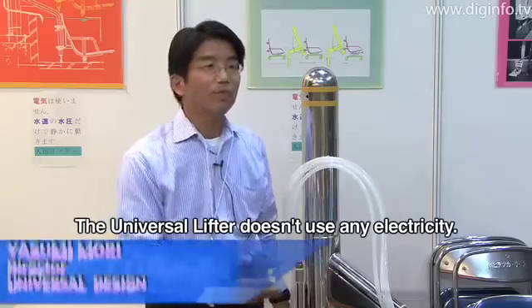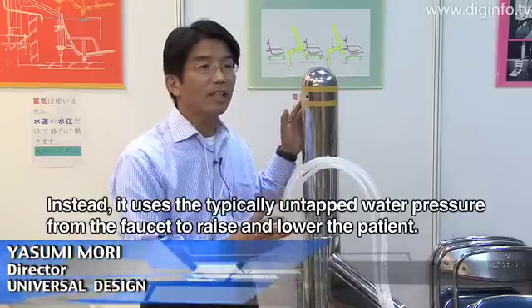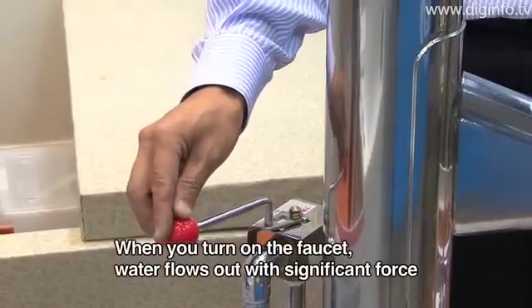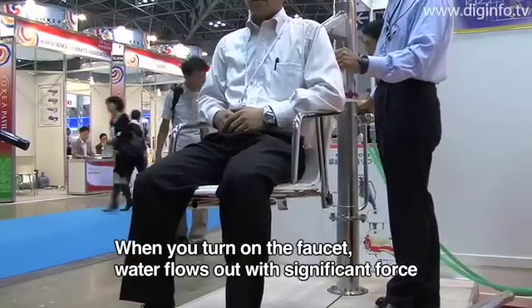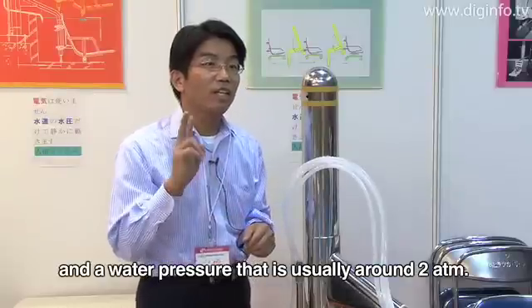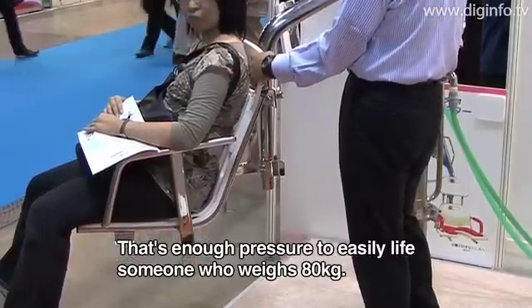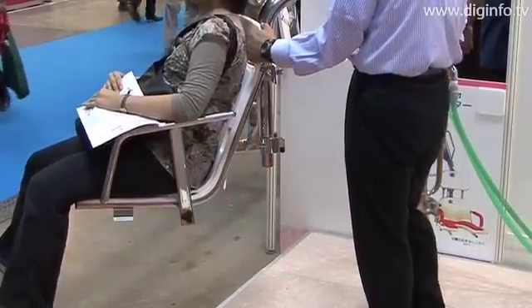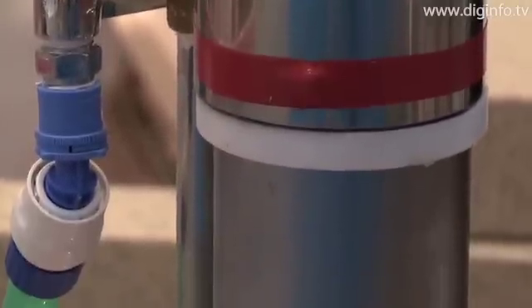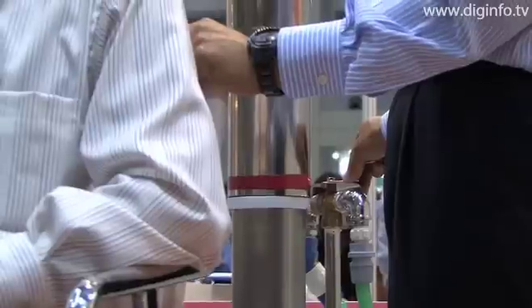This Universal Lifter does not use electricity. The water pressure is also very quiet. The water fees to raise and lower a patient one time are around 1 to 2 yen, and there are absolutely no electric fees.